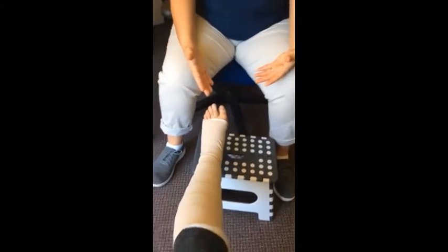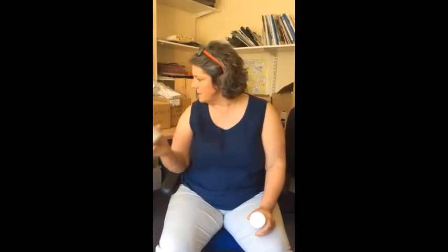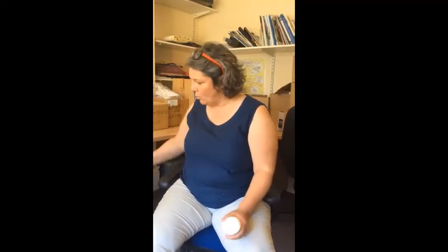Sarah has very kindly offered to be our patient today. I've already bandaged her leg and all that's left to do now is to apply the stump bandaging — this would be the way that you would do it. We're using Actico bandages for this, so whatever your regime for the rest of the leg, you'd apply that and then come back to put the stump bandaging on top. For the stump bandaging you're going to need some Ksoft to adequately protect the toes and the pressure areas, and you're going to need the 8cm Actico bandage. You will also need some scissors for cutting it.